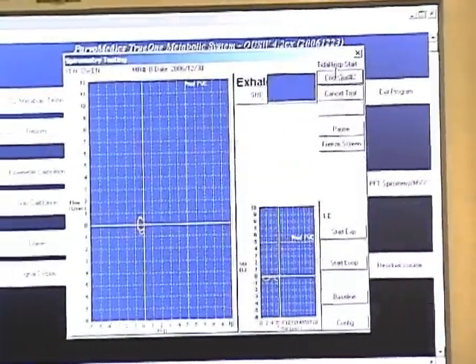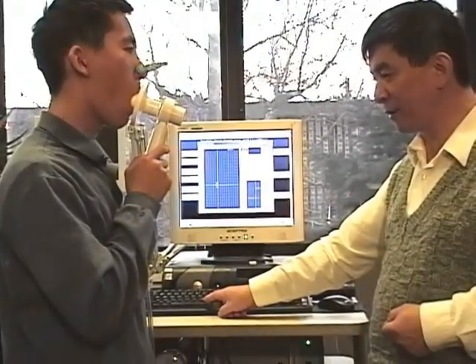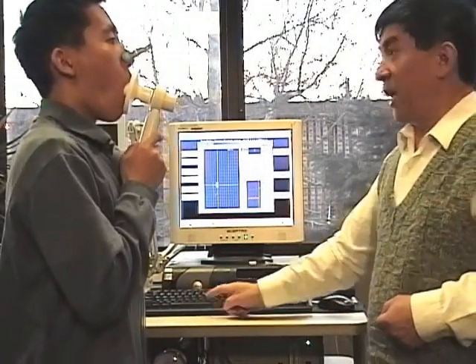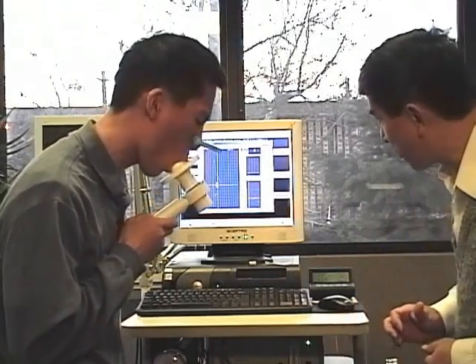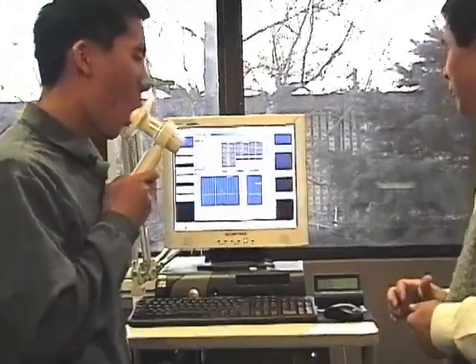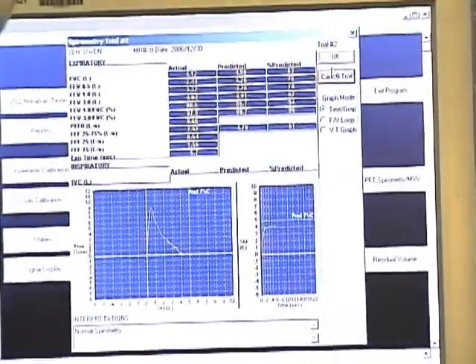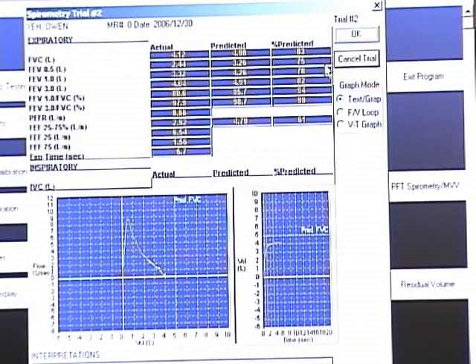Inhale big and hold. Then exhale as fast as you can — keep going, keep going, keep going. This result is at least 83% of predicted instead of 69%. The subject made 4.12 liters in FVC — that's a good one. It's a normal spirometry result. We'll let the subject relax for a second or two, then do the third trial.